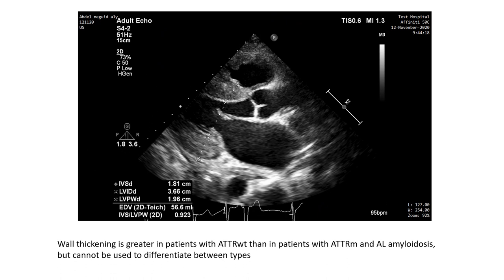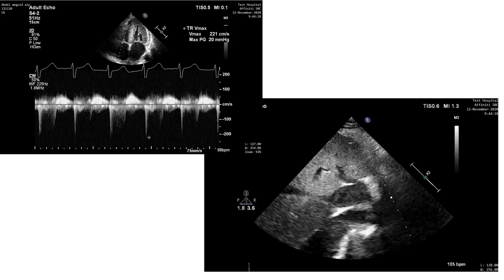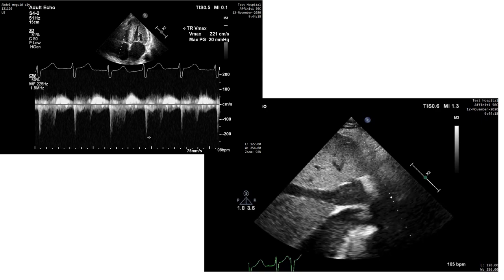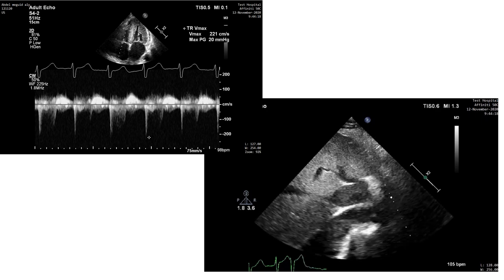Taking our measurements, the septum was 18 millimeters and the posterior wall was 19.6 millimeters, encroaching on the left ventricular cavity. The left ventricular end-diastolic diameter was 3.6 centimeters.